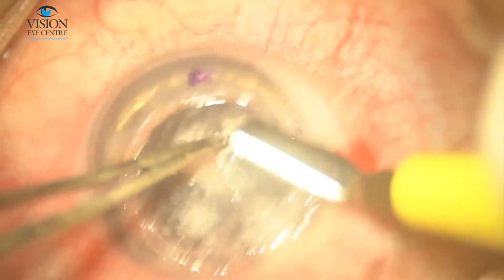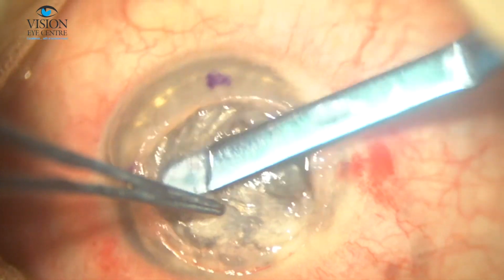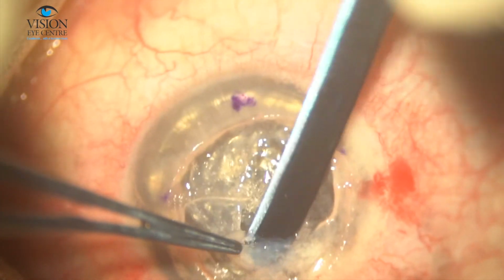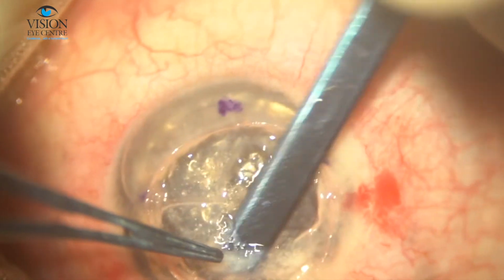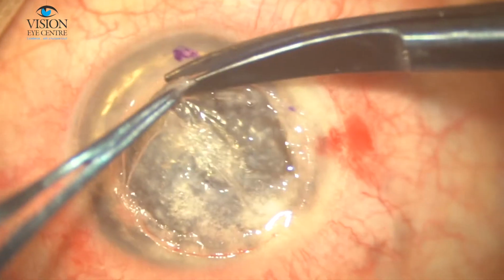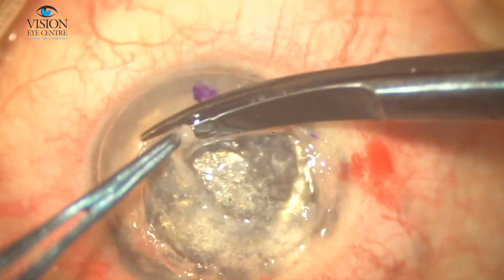As we go deeper into the posterior stroma, it becomes even more important to be extremely careful with dissection to avoid a perforation from happening, and therefore it's extremely important to use blunt dissectors and scissors with a blunt tip.